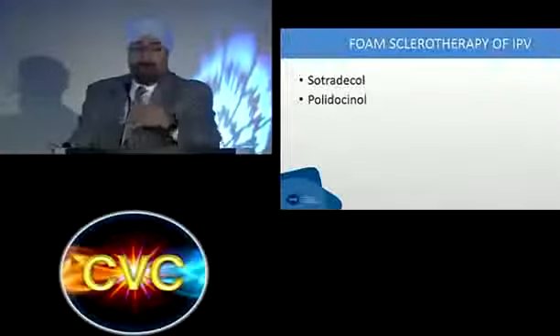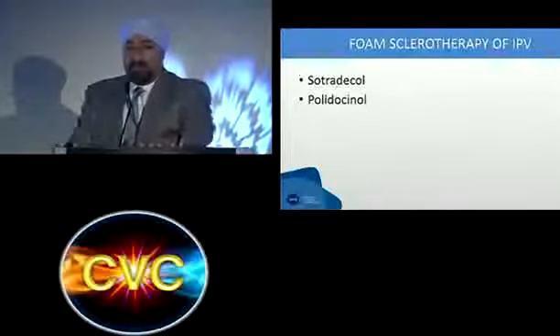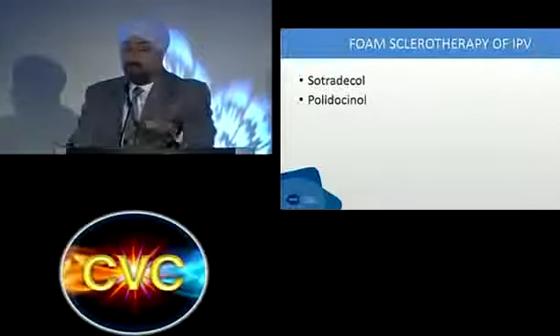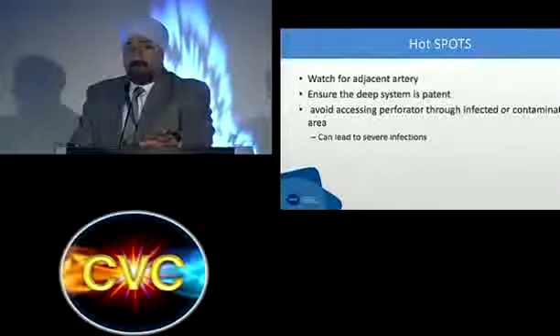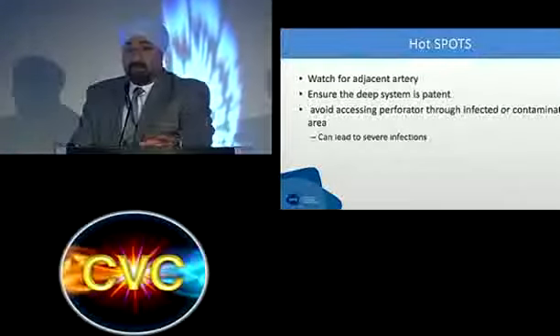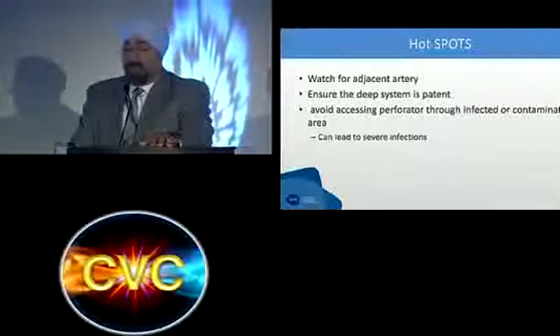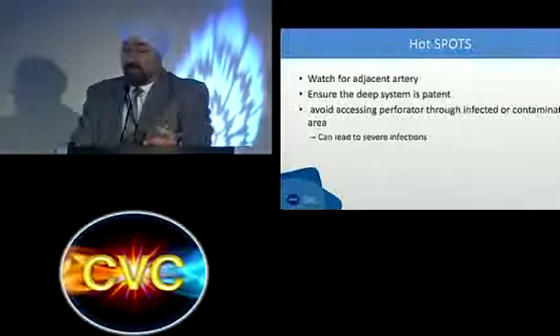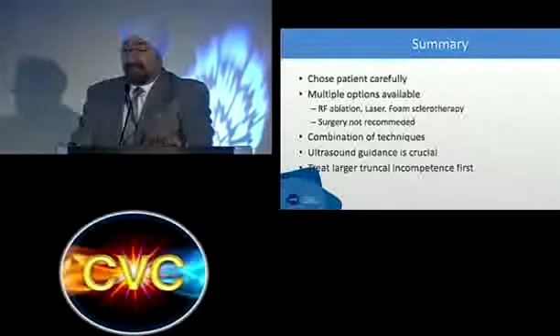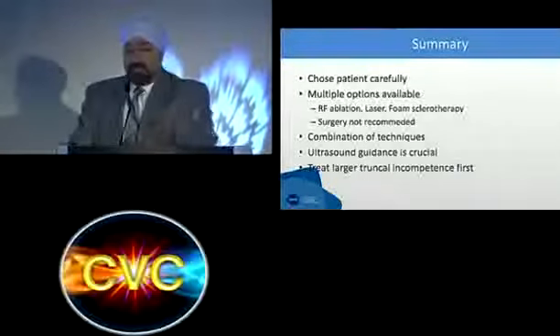The foam is all the standard foam techniques you've heard, Sotradecol, polidocanol. You can use some of the newer ones. The real issues are watch for the adjacent artery. You can hurt the skin, be careful about that. Make sure the deep system is patent. Don't go through a contaminated area. So choose your patients carefully. There's a lot of different options.